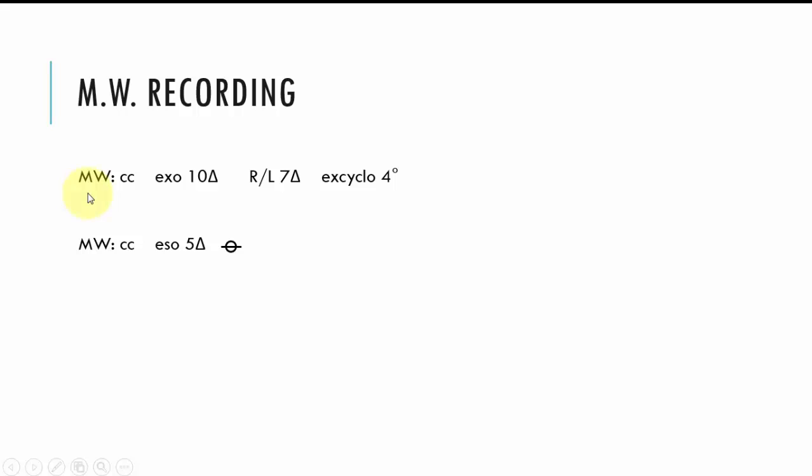Recording the Maddox wing: MW represents Maddox wing, we indicate whether the patient is wearing correction or not, and then we indicate the size of the deviation. So here we have exo of 10 diopters, and as I said earlier you'll need to clarify that the arrow was actually pointing to the 10 and was not between the 9 and the 11 as an example. Now we have right on left so there's a vertical deviation of 7 diopters, and here we have ex-cyclo at 4 degrees. Torsion is always measured in degrees.